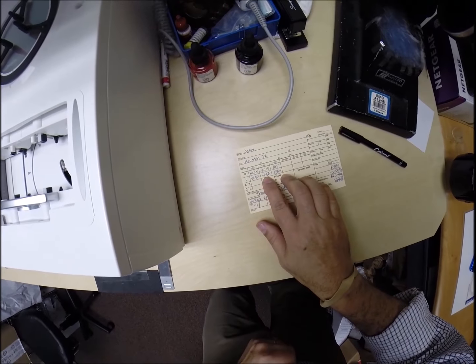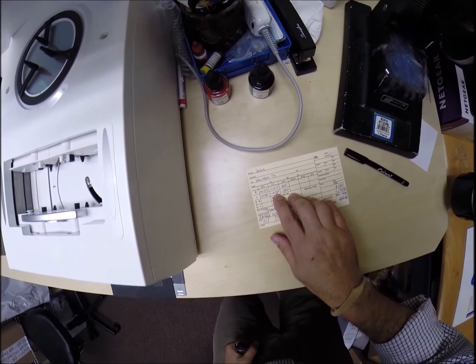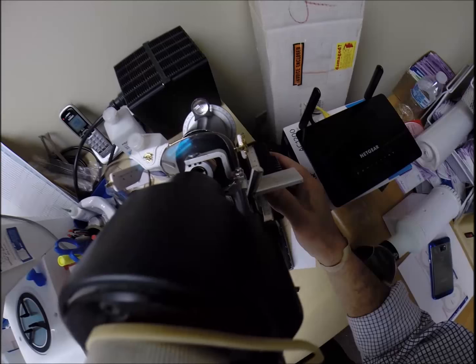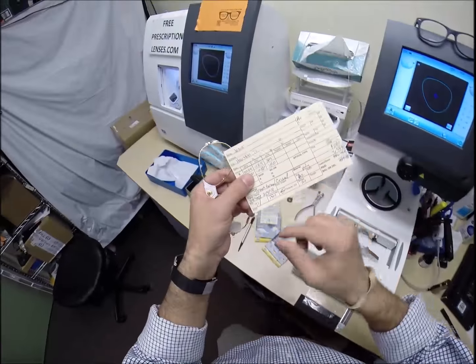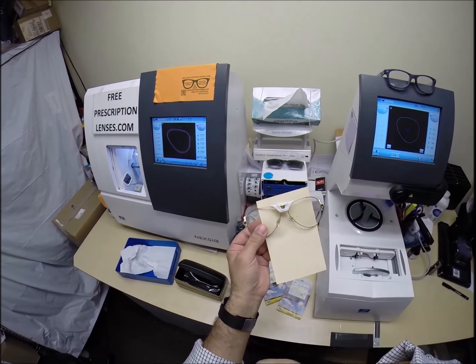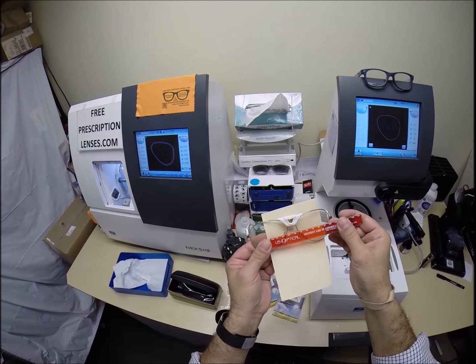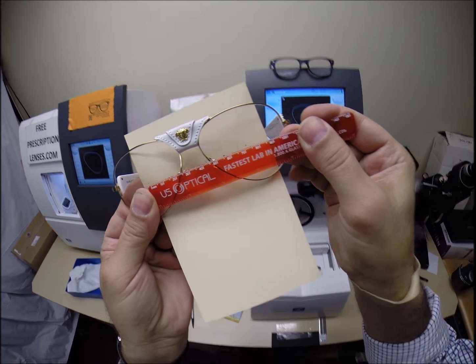-50 plus -50. If someone owed you 50 cents and they borrowed another 50 cents, they would owe you $1. Let me check your astigmatism. We end up at -1 again perfectly. So I couldn't have done a better job if I had done this myself. Your pupillary distance is 71 for both eyes. When I turn the card around, I'm going to place the PD stick against my thumb on your right lens. And then when we check on the left lens, we're getting 71, so that is cut perfectly.